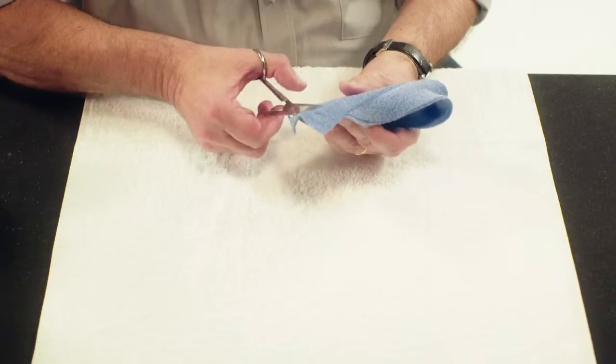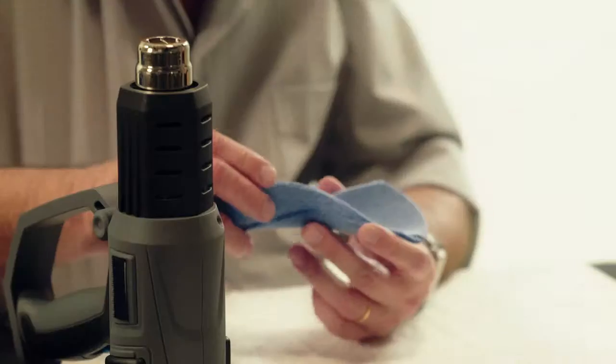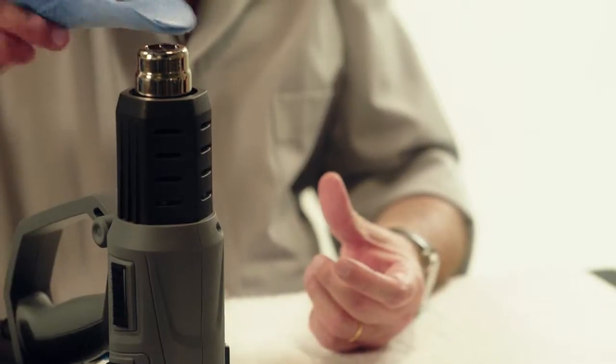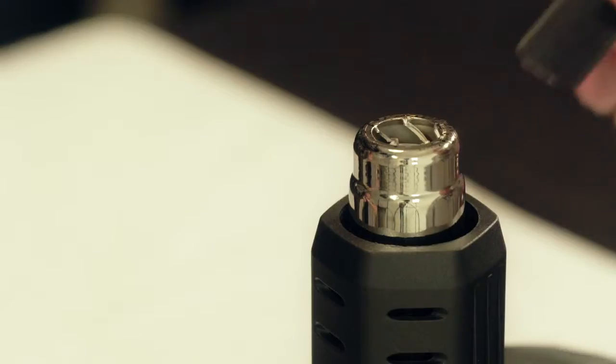Round the corners of the orthosis. Heat the dorsal part of the orthosis with a heat gun.